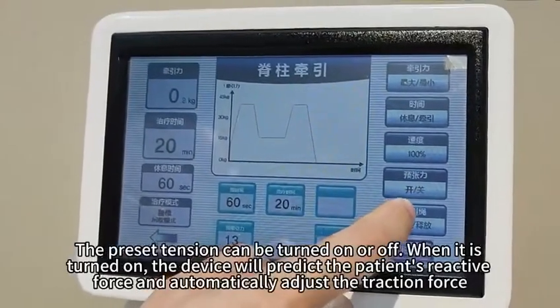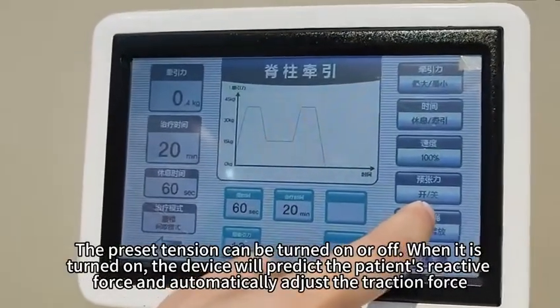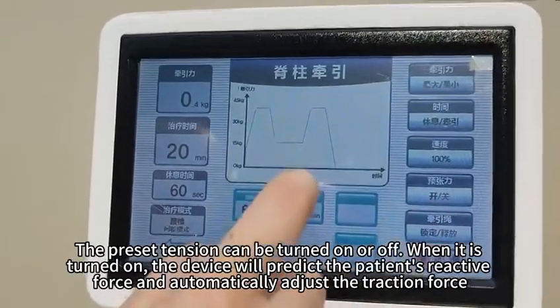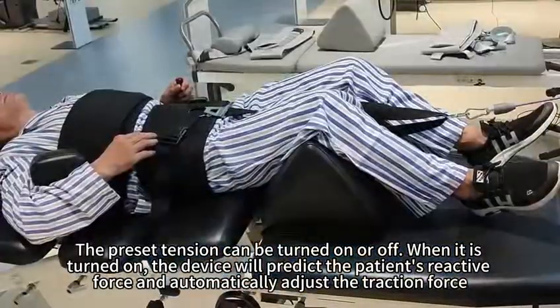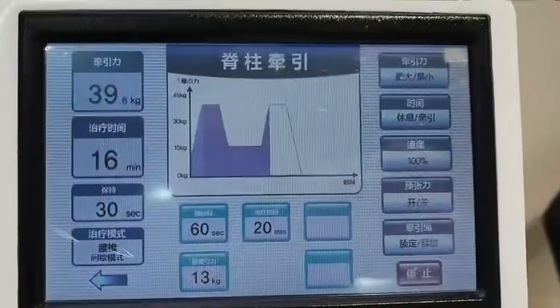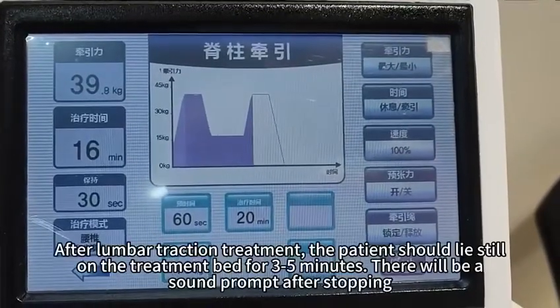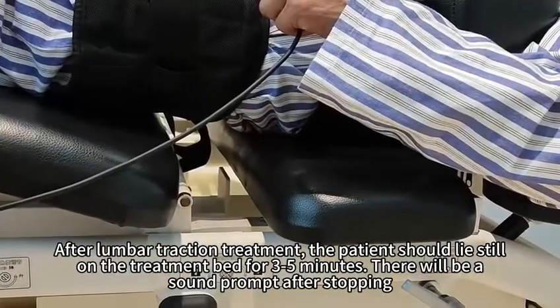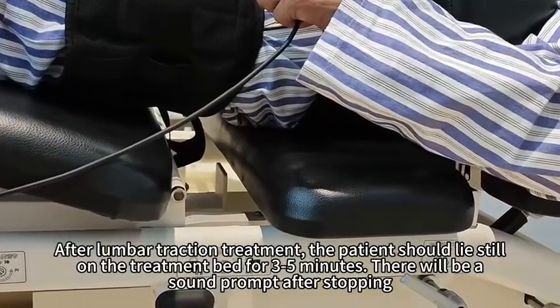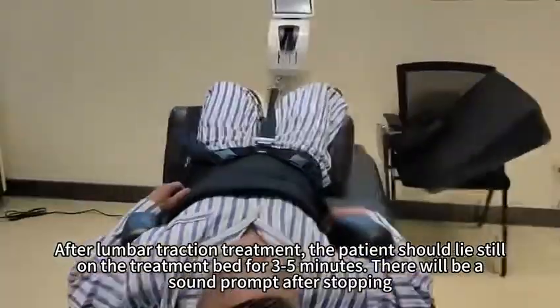The preset tension can be turned on or off. When it is turned on, the device will predict the patient's reactive force and automatically adjust the traction force. After lumbar traction treatment, the patient should lie still on the treatment bed for 3 to 5 minutes. There will be a sound prompt after stopping.